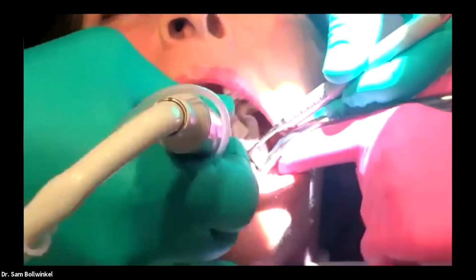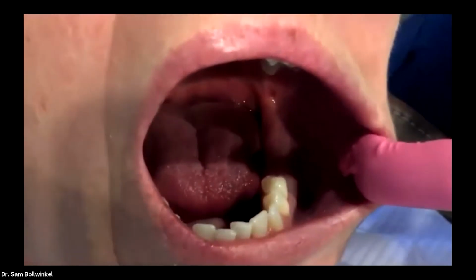Fantastic. So let's go ahead and take that throat pack out. Awesome. So with that being in place, let's take a look at that. Can you see that, team? Okay, so that has really strong bone. This extraction was done in September.